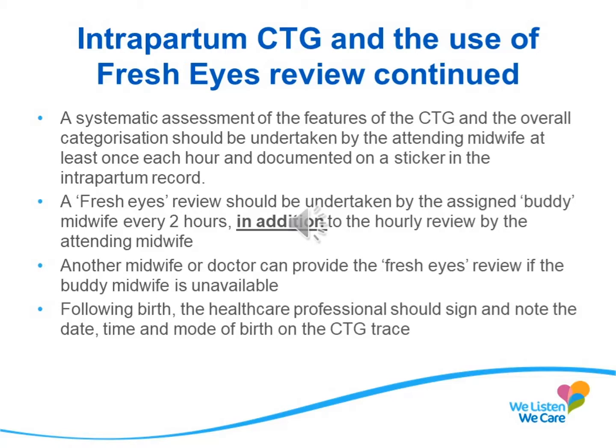Following birth, when the CTG is discontinued, the midwife should sign and note the date, time and mode of birth on the CTG trace.